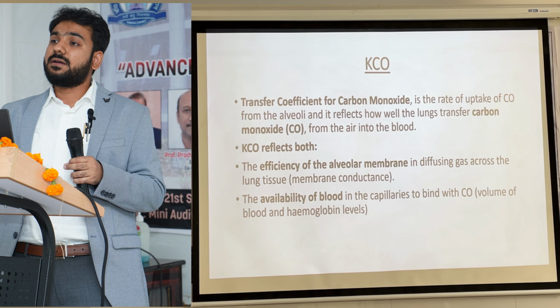Okay, there should be proper amount of blood in the capillary which has proper amount of RBCs and the RBC should have sufficient amount of hemoglobin. Okay, it has two important components and KCO is the efficiency index. Whatever alveolar capillary membrane is there which is functioning, how well it is transferring the gas. So KCO is telling us that.